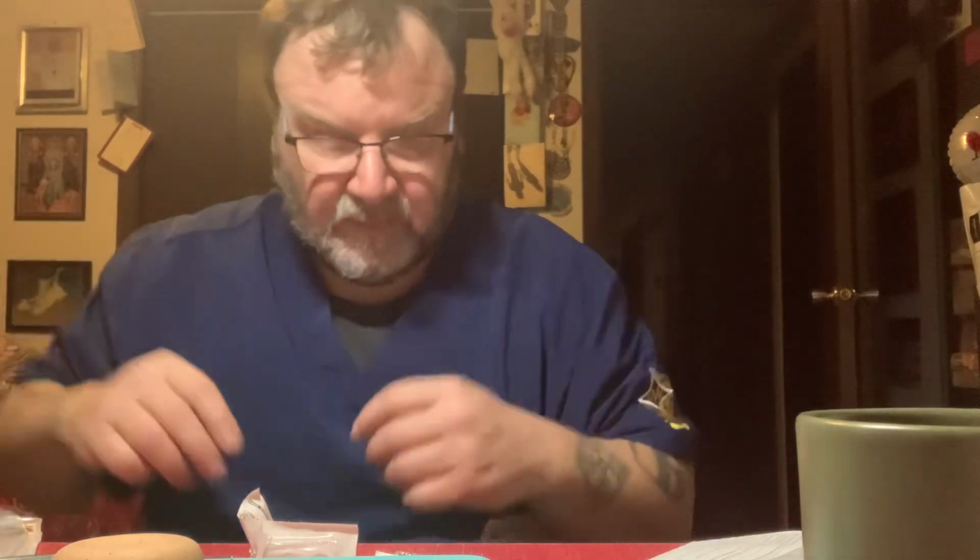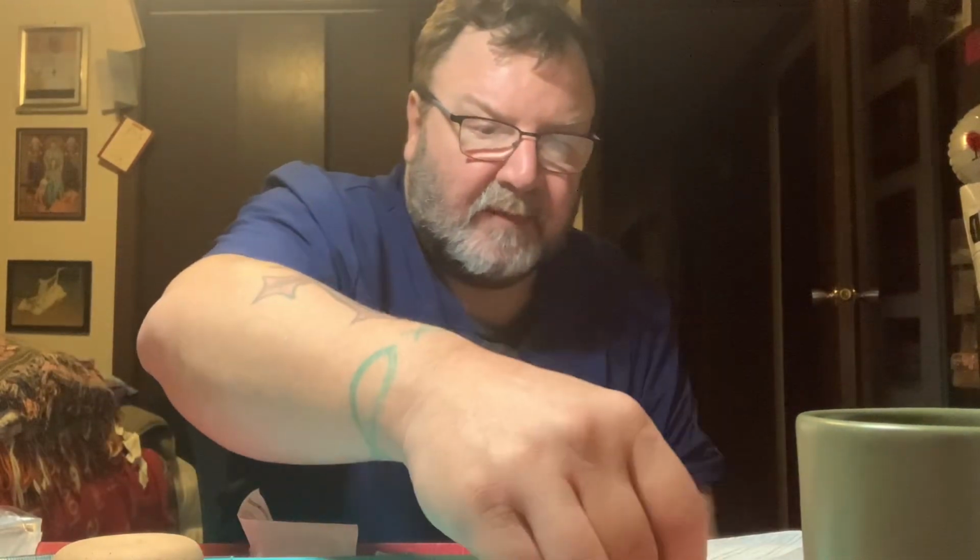Okay. So I have that into my filter. I will set that down for now. I will take my medication and my container to the bedside. There I will identify Mr. Rocker by his name and birth date using his armband. Skip Rocker, 1/1/1972. Ask him about allergies.